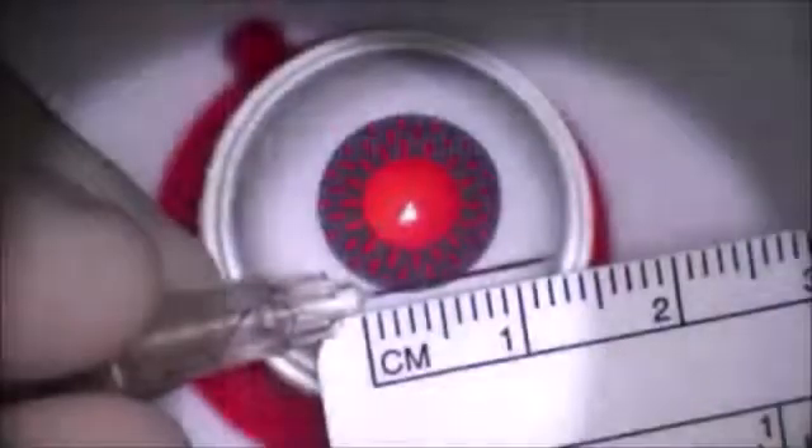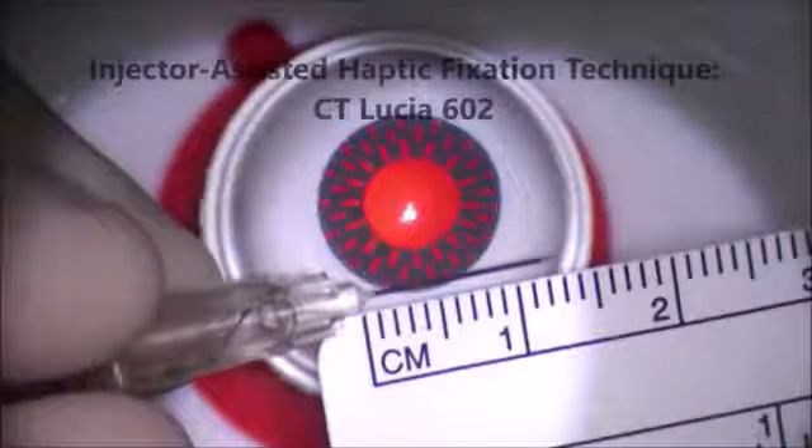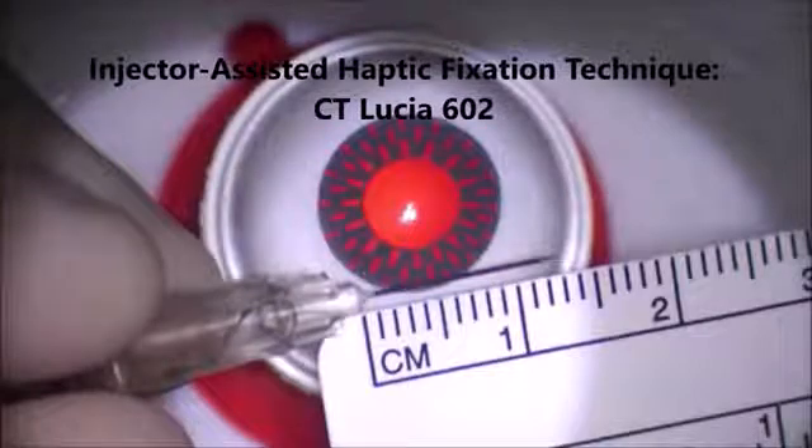You can purchase these fake eyes at simuli.com — they come in a pack of two. I have taught several wet labs at AAO and ASCRS using these Simuli models to teach the Imani technique, and it is extremely helpful. There is a model eye specifically designated for intrascleral haptic fixation technique. I'm going to do the injector-assisted haptic fixation technique using the CT Lucia 602 lens.